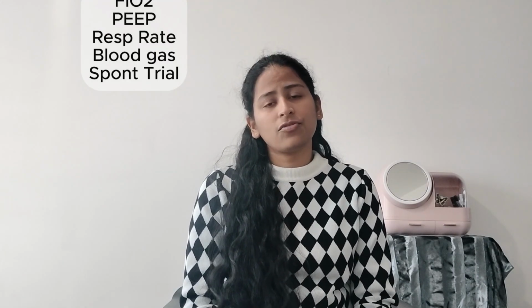You want to see if you can trial them on SPONT. So there are different modes on the ventilator setting, and SPONT trial is spontaneous, which means that the patient is taking their breath by themselves and the ventilator is supporting the breath, but the patient is the one who's initiating them. So spontaneous trial means both the patient is awake to take their breaths. Second thing, that they are generating enough inspiratory effort to maintain the tidal volume that they need. So ideally you want them to be on spontaneous mode of ventilator for about at least 1 to 2 hours to make sure they're not tiring on a spontaneous mode.